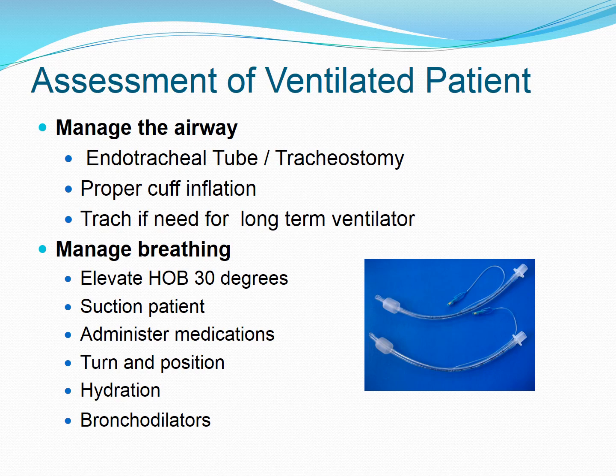So when they put this endotracheal tube in, there's a cuff on it, and then they inflate that cuff. Proper cuff inflation is necessary to prevent tracheal irritation and damage caused by that balloon that's blown up in there. Patients are usually only intubated for about 2 weeks. If they're still on the ventilator after about 2 weeks, they have to go have a trach put in.